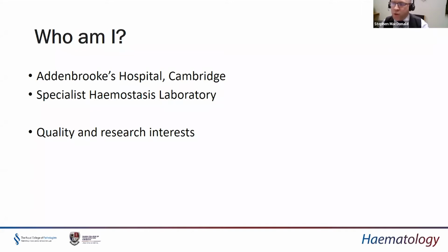Previously in the UK, we used to be accredited in the laboratories by an organisation called CPA, Clinical Pathology Accreditation, and round about nearly 10 years ago now, there was the beginning of a transition across to doing ISO 15189 accreditation under the UK Accreditation Service.